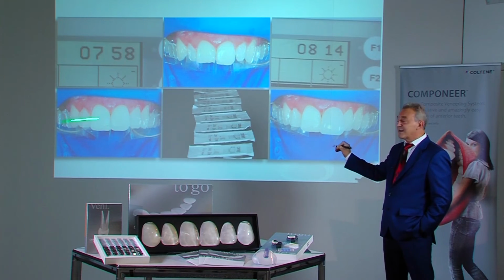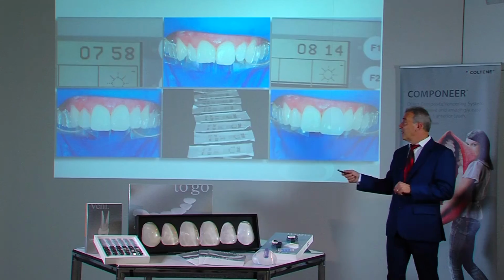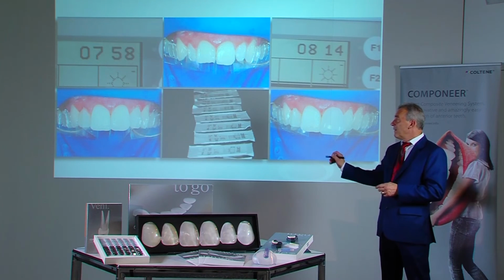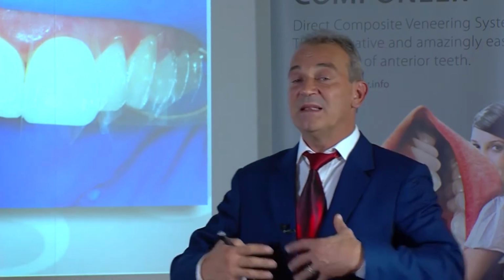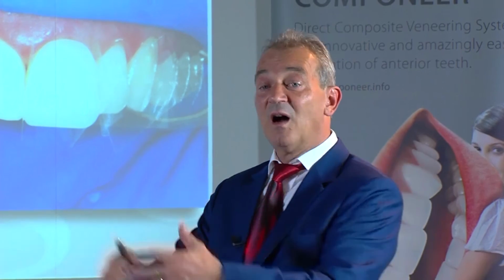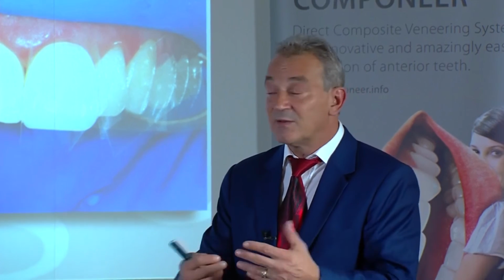Beforehand, the background was again corrected with dentine mass. That means the lateral incisor was built up slightly to round off the dental arch. A touch of dentine was also placed on the premolars, so that not too much enamel mass is applied together with the componeers. In the chapter on colour shade management, we saw that too much translucent mass can cause a grey tone.